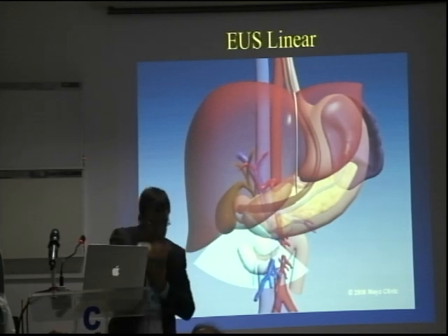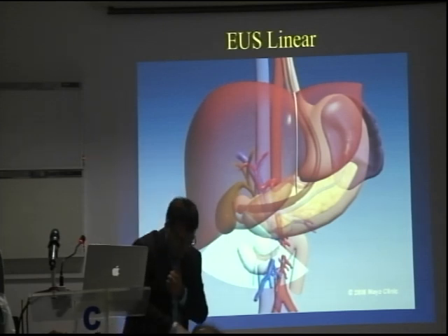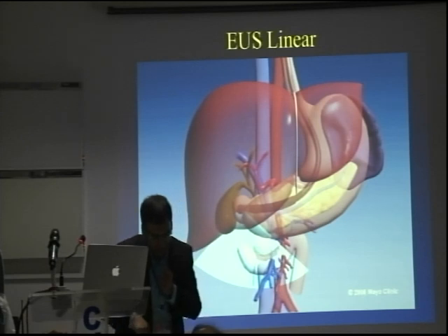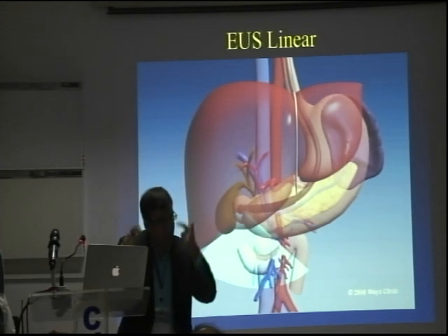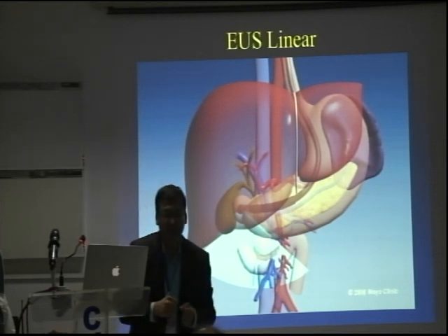When I'm looking from the stomach at the pancreas, I'm looking down. When I'm looking from the duodenal bulb, I'm looking up. That made sense to me, so I made that image in my head, and every time, that's how I use it.